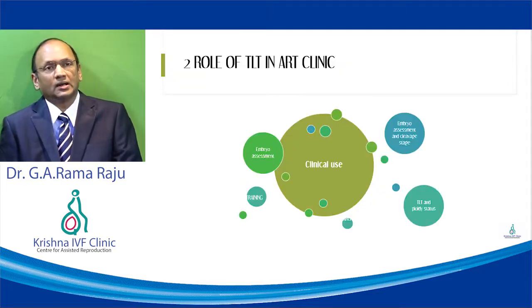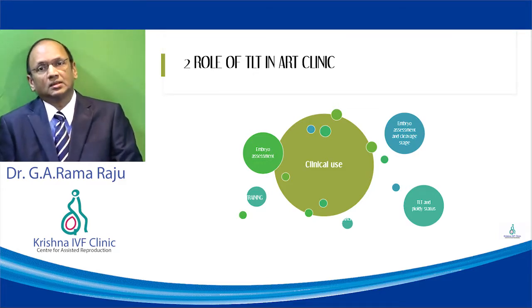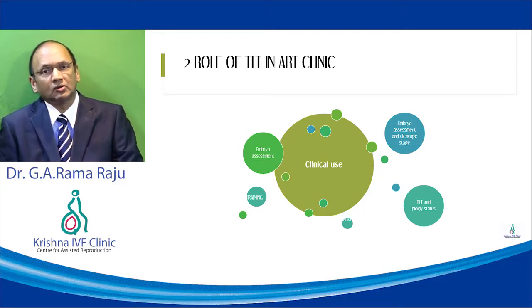What is the role of time-lapse technology in an ART clinic in 2020? It is basically used for embryo assessment. The second area is that it is also used to predict the fertilization events and then look at the possible cleavage patterns and blastocyst development.